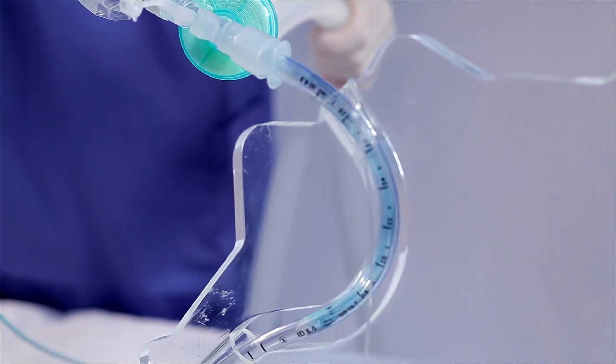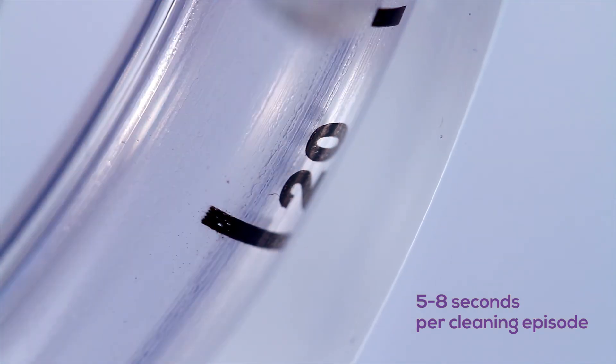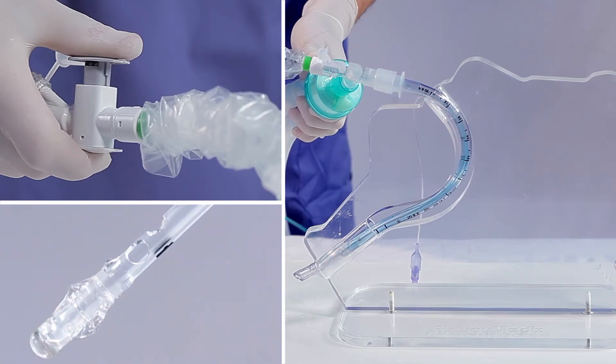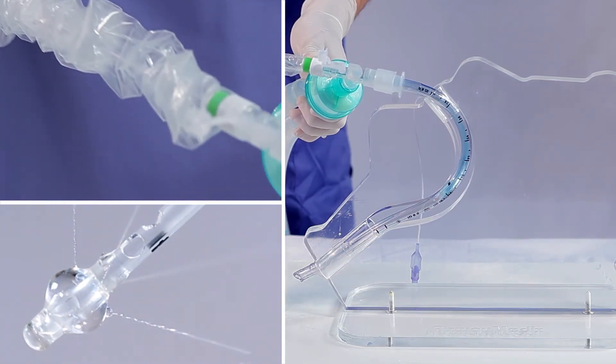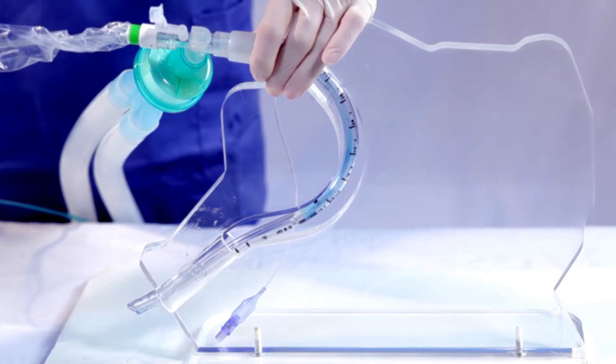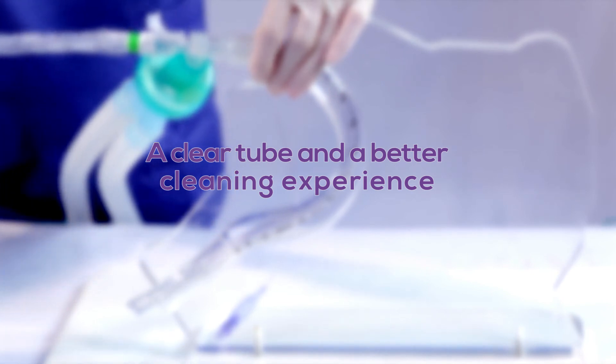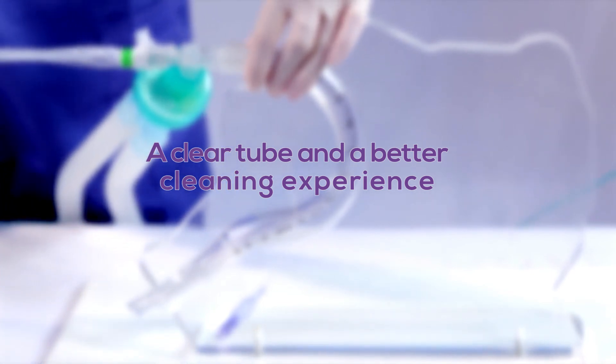The duration of the suction episode should be no longer than five to eight seconds. Repeat as needed for a patent airway and perfect results. As you can see, you are done in just seconds. The Airway Medics produces a clearer endotracheal tube and a better cleaning experience with less soiling of the patient and you.